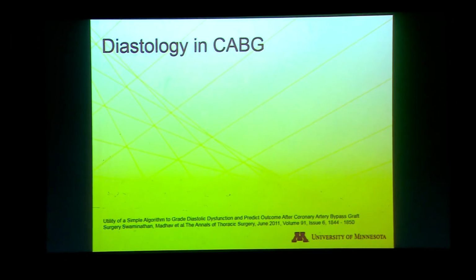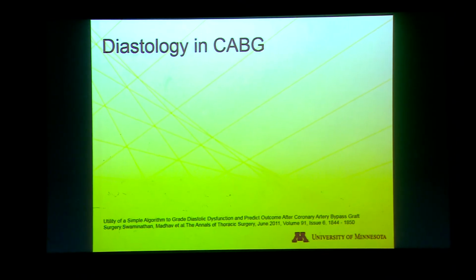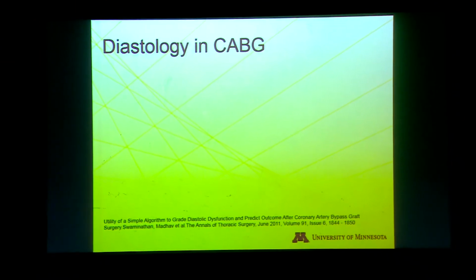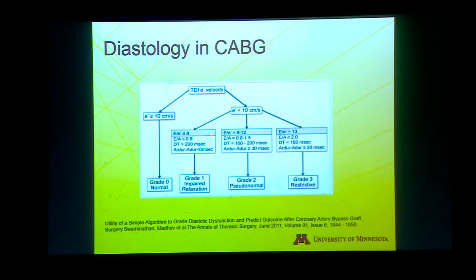So Dr. Swaminathan did this landmark study for assessing diastology in patients undergoing coronary artery bypass. None of these patients had valvular pathology. The purpose of the study was to see if a simplified algorithm is as good as a more complex algorithm. This is from 2011 when the ASE guidelines had not been revised. What they did was look at the ones in gray, the simplified algorithm, as opposed to checking all these parameters, which is part of the algorithm for diastolic dysfunction from the previous guidelines.